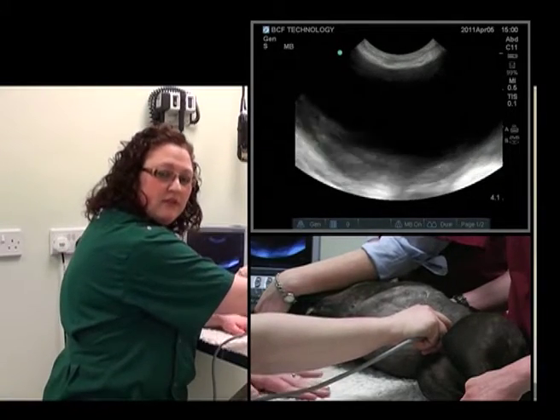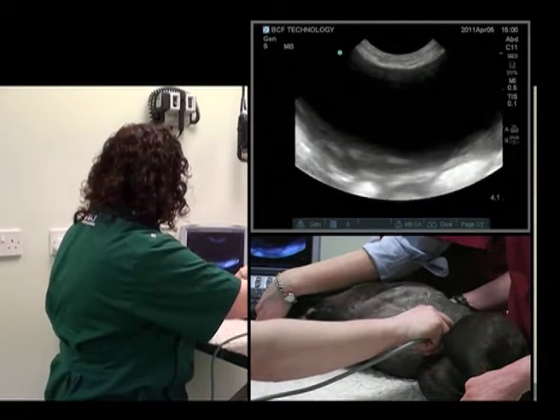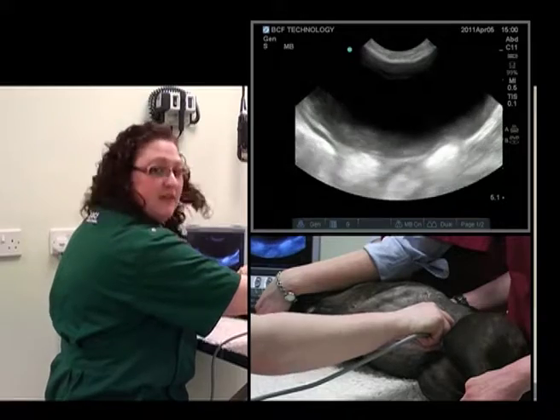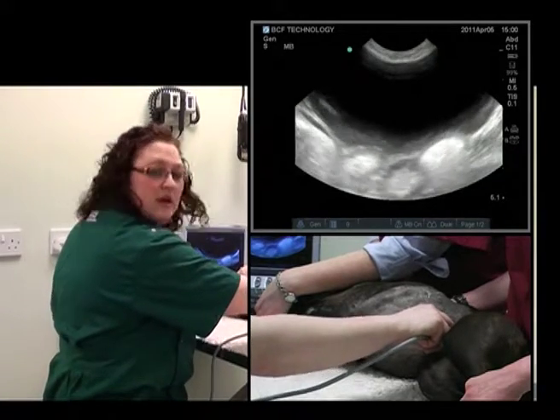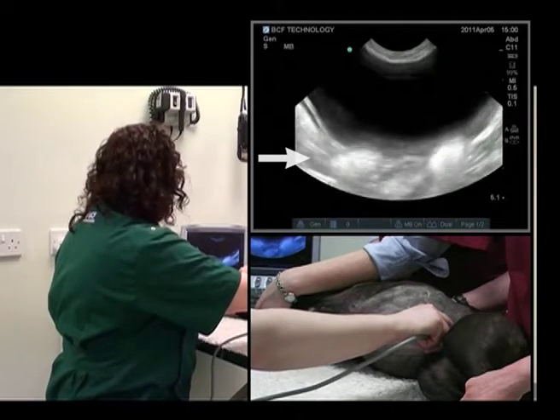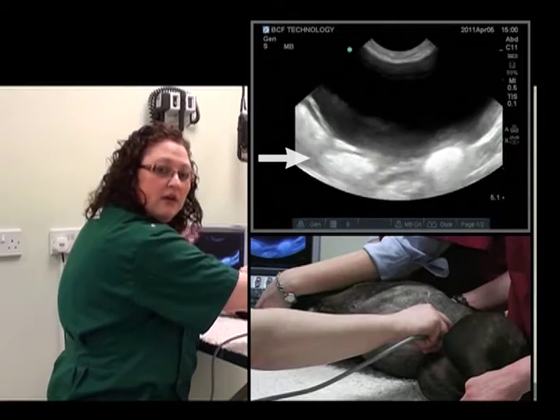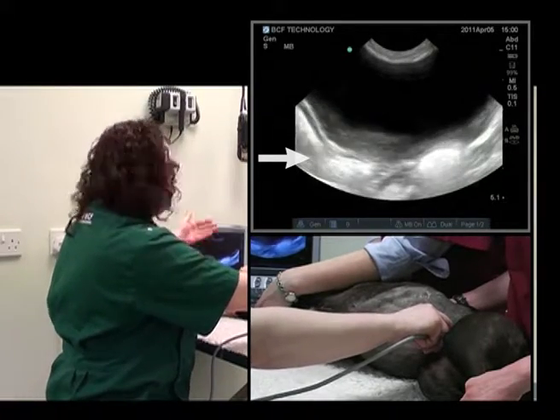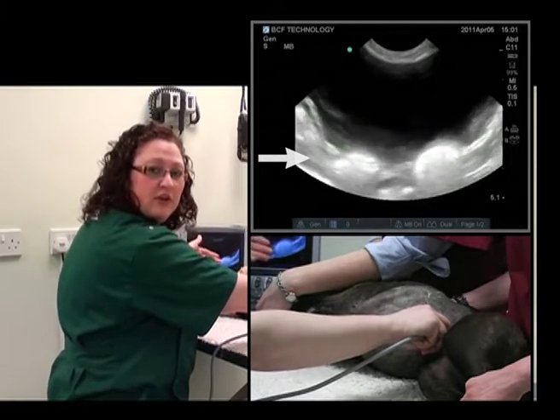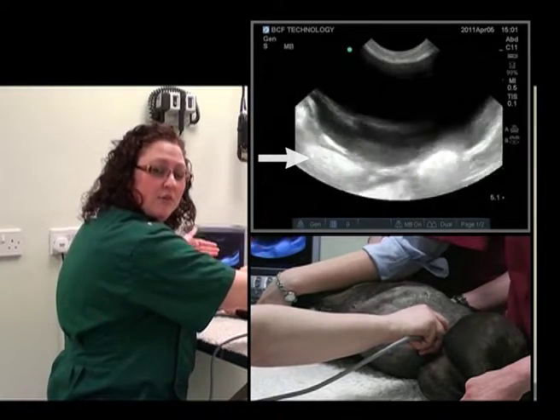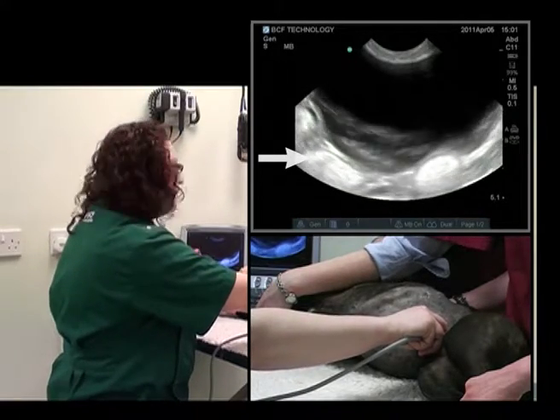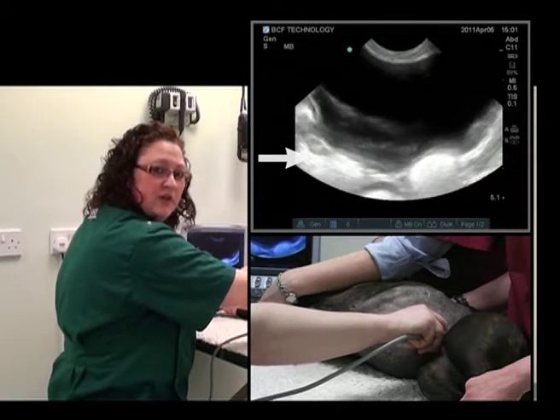We'll need to adjust the depth, the gain, and the time gain compensation again. I think this looks a little bit too bright in the far field. This is a result of the fact that the echoes are not being attenuated as they go through the bladder — they're not coming against any resistance — and so the deeper tissues underneath the bladder are a bit brighter than they actually should be. This is called acoustic enhancement and is an artifact, so we'll need to adjust for this with the time gain compensation.